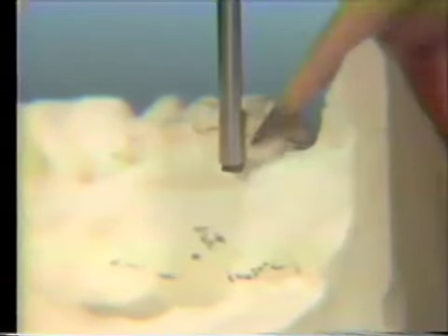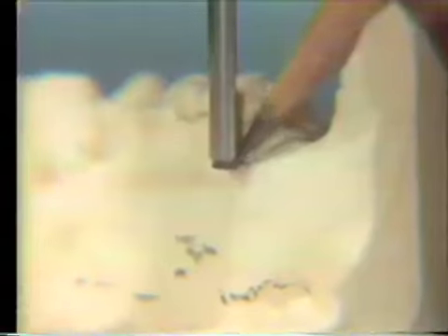Now these points should be as far away from each other as possible. It'll make it a little bit easier. Right here, at the distal aspect where the gingiva and the tooth meet. Now the center of those marks is the tripod point.